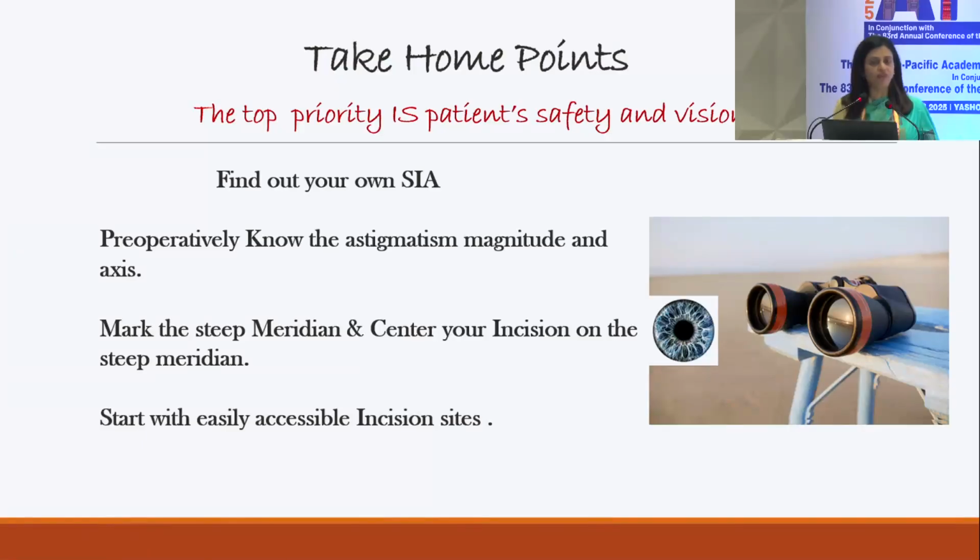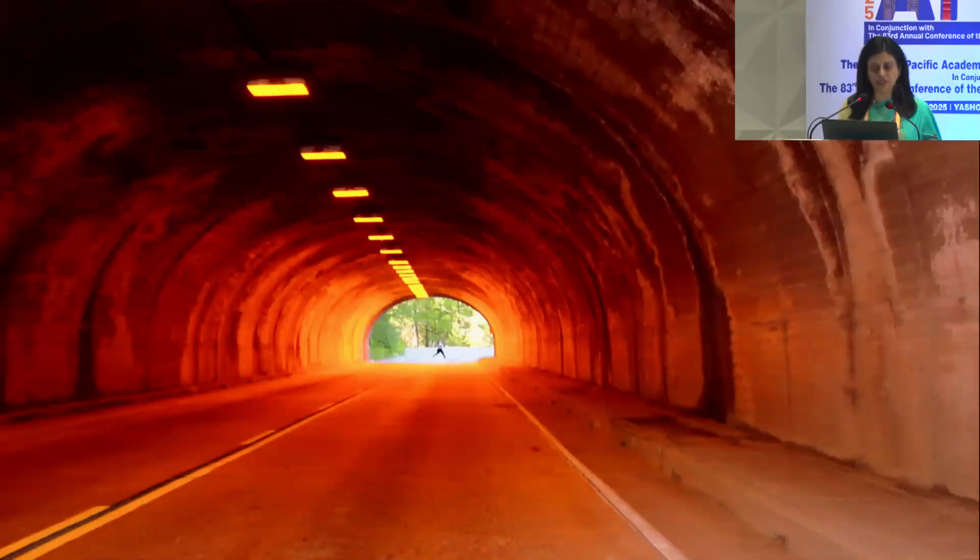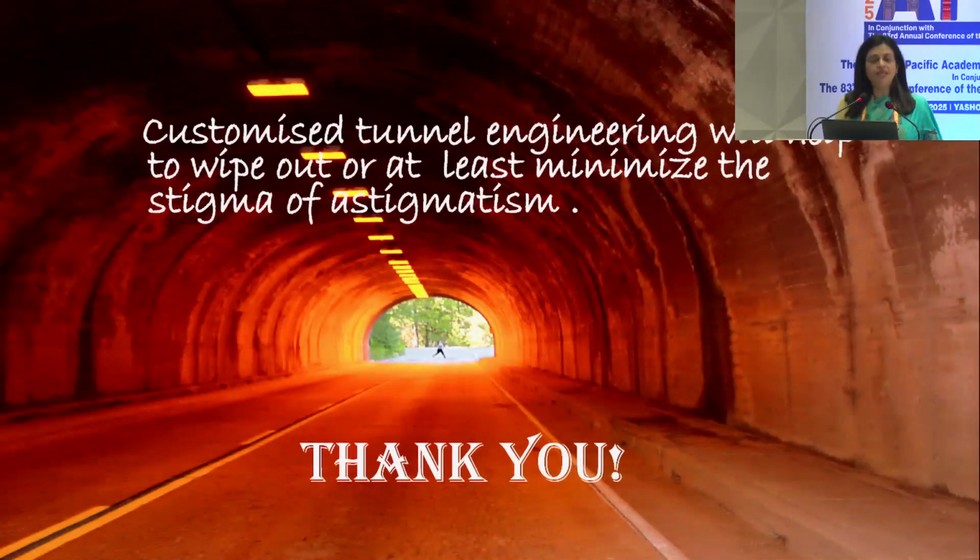To start with, you start with the accessible area, maybe superior or superior temporal or temporal, that will give good results. So customized tunnel engineering will definitely help out, or at least minimize the stigma of astigmatism. Thank you for attending and patient hearing.